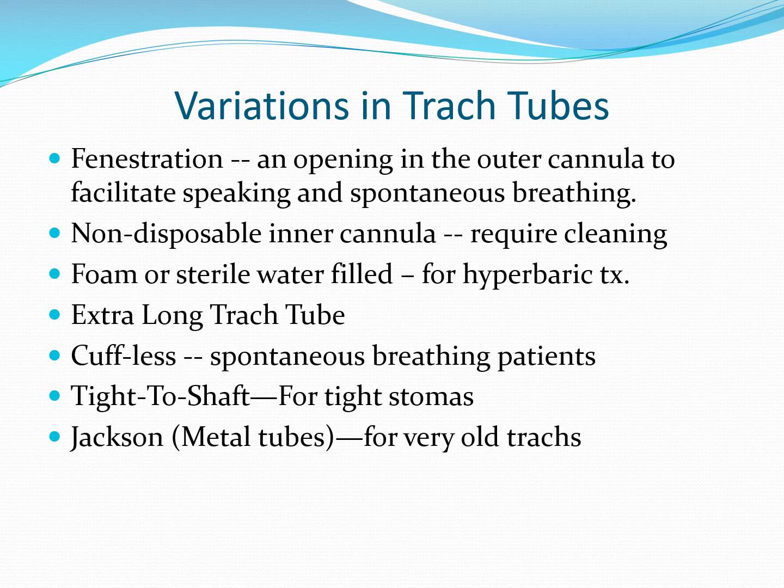There's other reasons as well why they're used. Extra long trach tubes, so they can be extra long, if you will, front to back, or they can be extra long up and down. Okay, and it really depends on the patient's anatomy. If you have a patient who's had their tracheostomy tube for a long period of time and they're developing tracheomalacia, they may be a good candidate to have an extra long, specialized tube that's put in place.